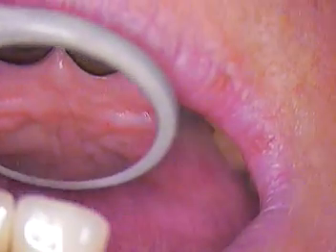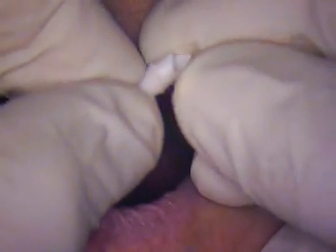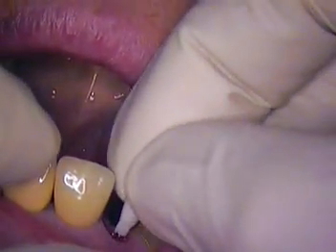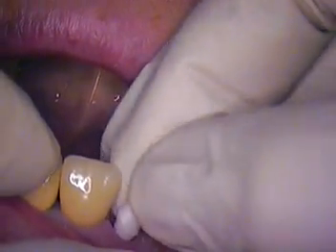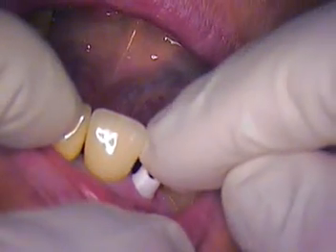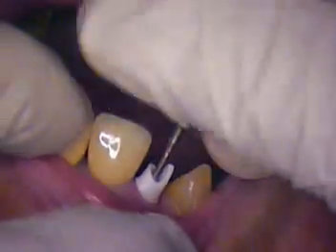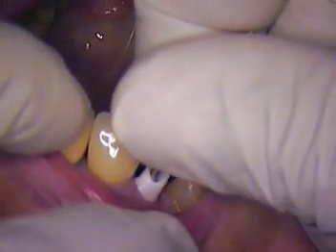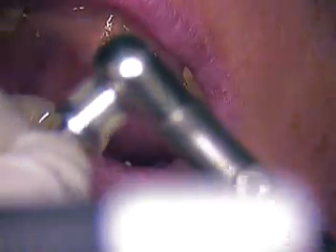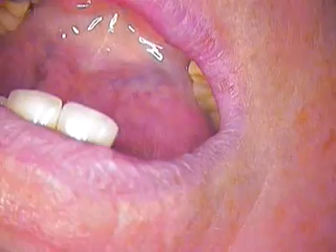So now we'll slowly put in the abutment. We'll slowly tie that in like so. There we go. And hand tighten that first and then we're going to torque it down. We have a special wrench for that, so you'll feel some tightening — not a lot, but some.